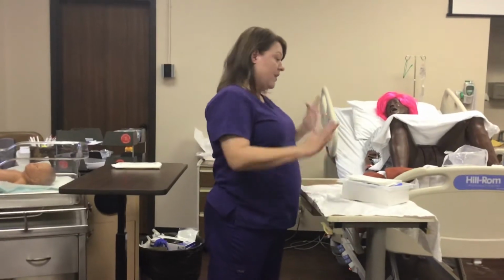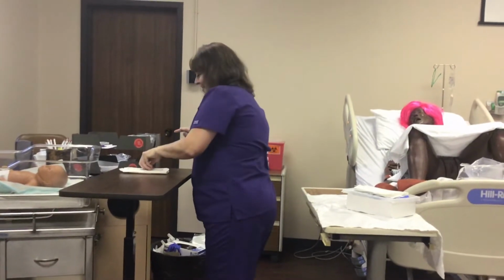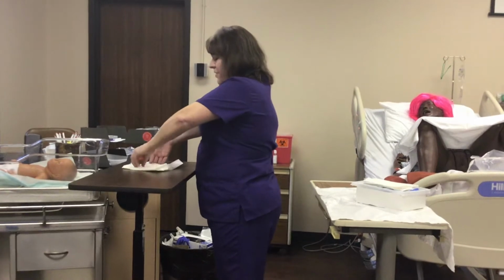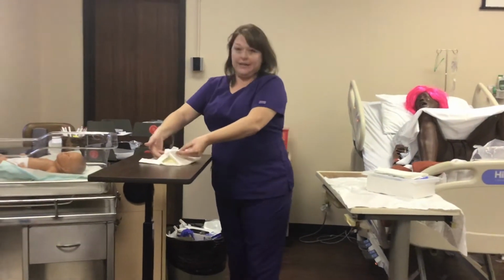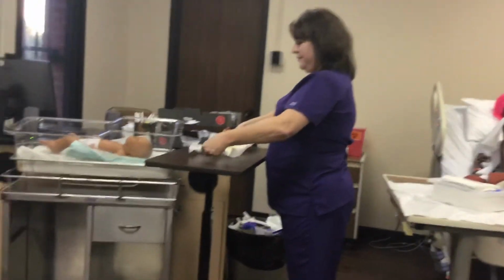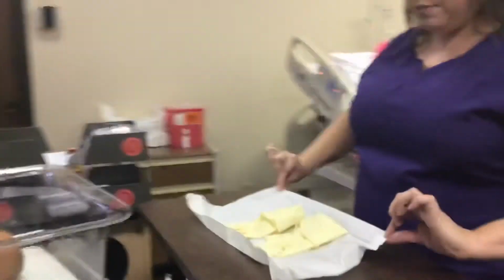Okay, so I laid this out. Now I'm going to turn and do my gloves again. All right. So I would take my fingers along the underside of the packet, the paper, like this. Okay, and then I'm going to pull and pull and pull.